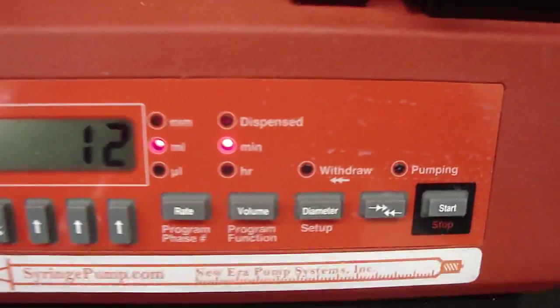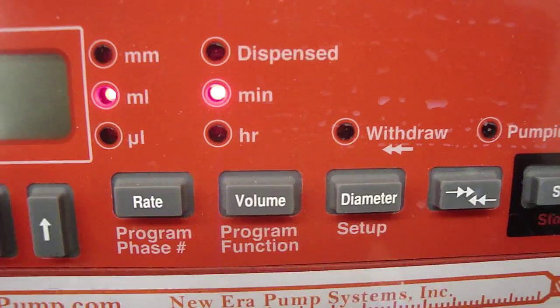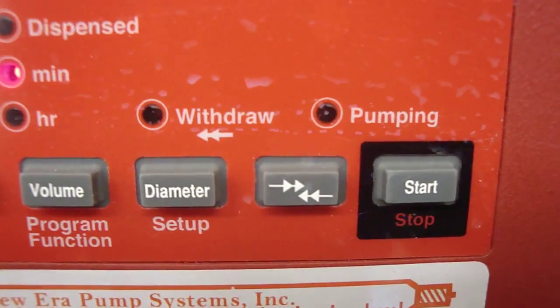And there are four function keys on the right, which are rate, volume, diameter, and the flow direction.